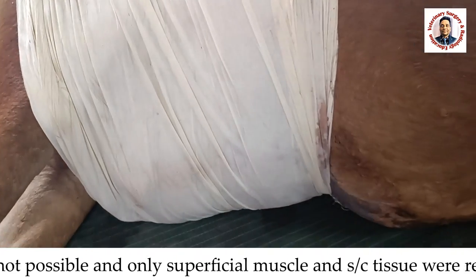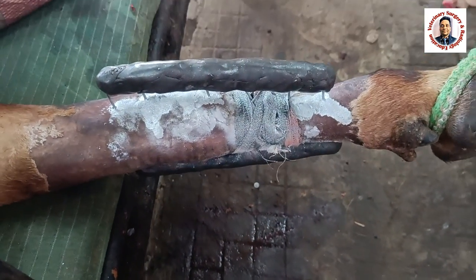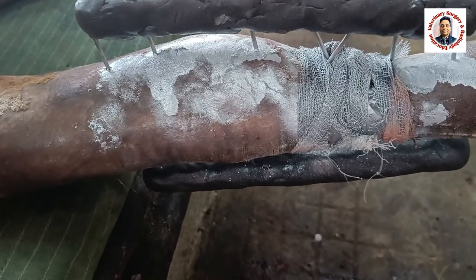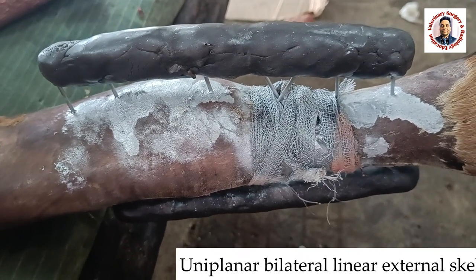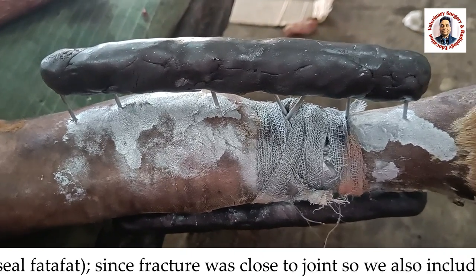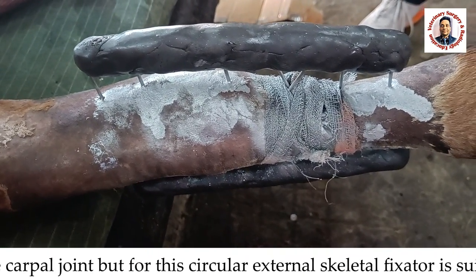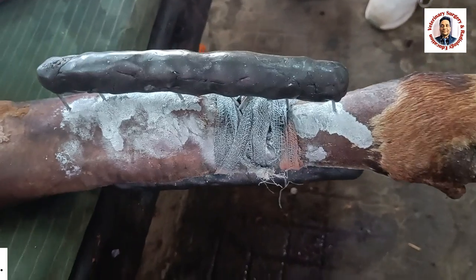This repair is not as per the standard protocol, and even a mesh will not work because there is a huge gap. As far as the fracture is concerned, it was very close to the carpal joint. We fixed this fracture with a uniplanar linear external fixator. However, this fixator is not so effective as we have incorporated the joint. In such cases, normally a biplanar fixator is required, but since biplanar requires inserting more and more pins, it is very difficult. We have done our best with whatever facility we have.